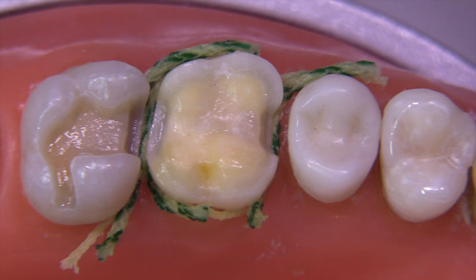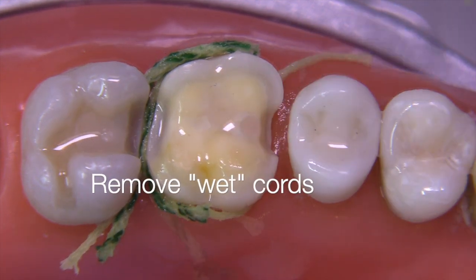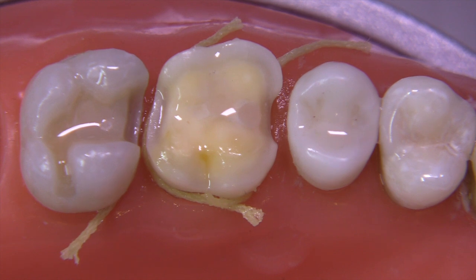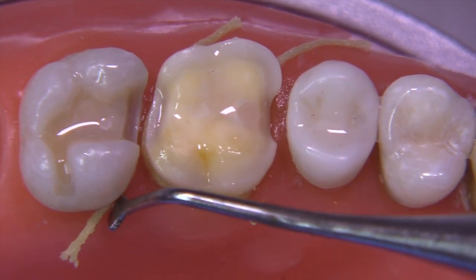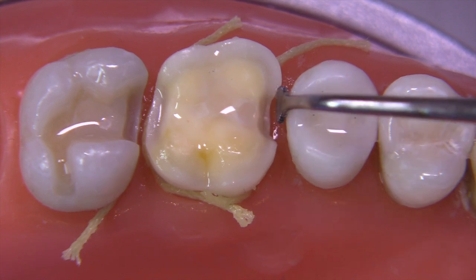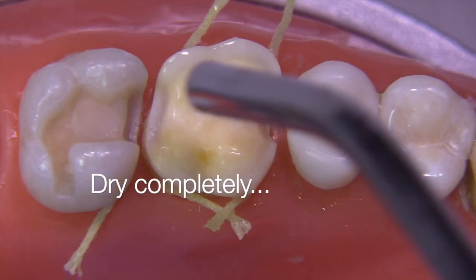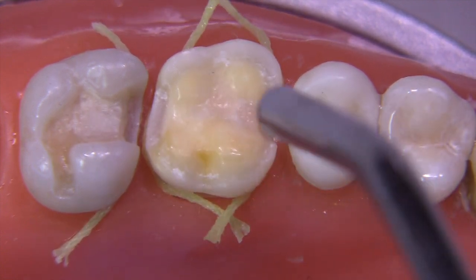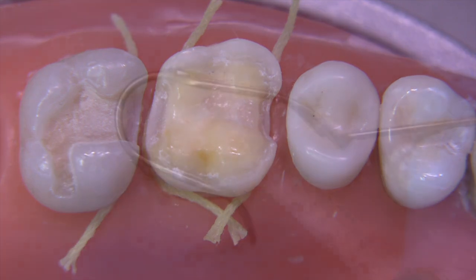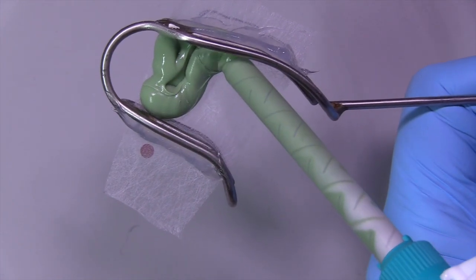Now we're ready. The patient has been sitting for about five minutes. We're going to remove the backups, rinse thoroughly with water to wash away all the medicaments, and allow the cords to be wet so when we pull them out they don't tear the tissue — very important to have wet cords. We want to make sure the zero cord is still in position; if you see it sticking up, push it down a little further so it's firmly within the sulcus and apical to the finish line. Now dry thoroughly — it's got to be completely dry for the impression material to capture all the details of these preparations. We'll load the tray with heavy body material.